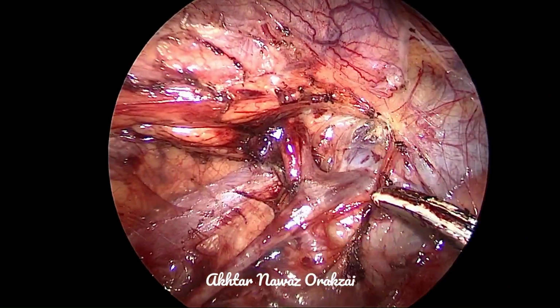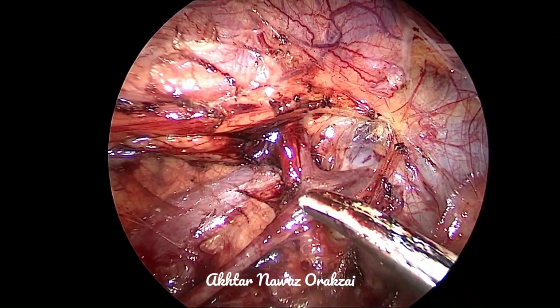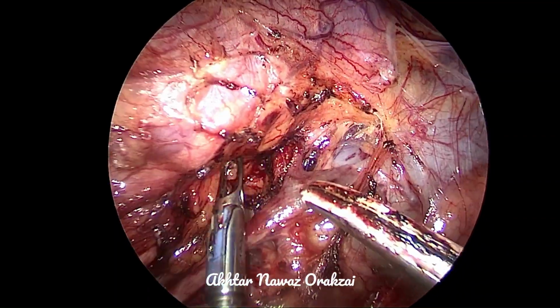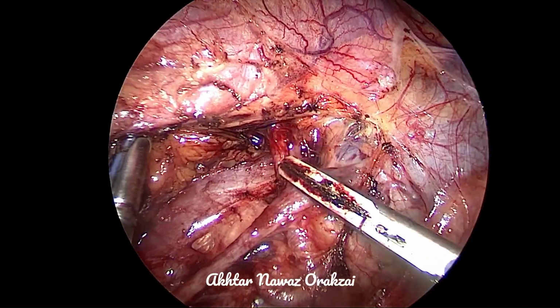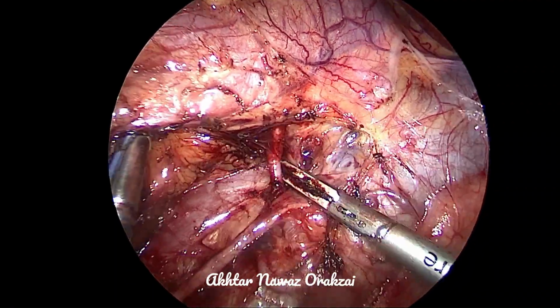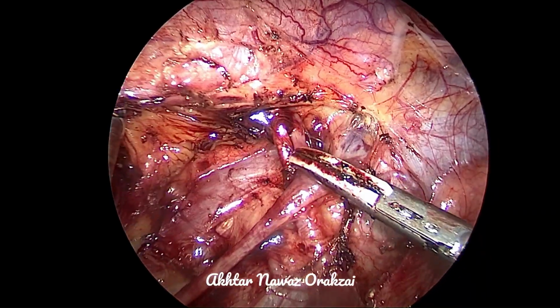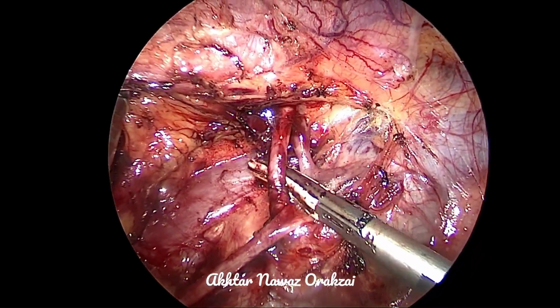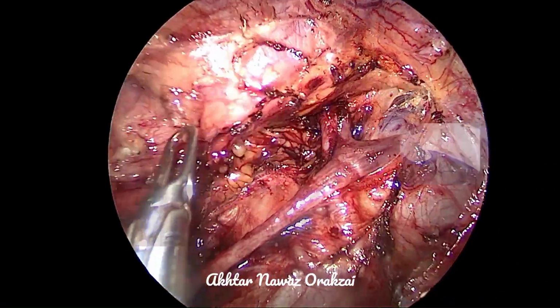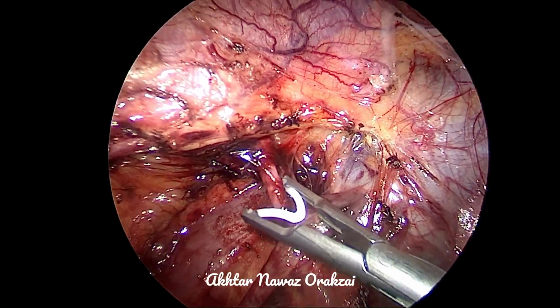Here you can see the structure going anterior to the IVC and posterior to the gonadal vein into the kidney. So this is a lower polar artery. Instead of avulsing the gonadal vein, we decided that we must deal with this pedicle. It will give us a dual advantage.